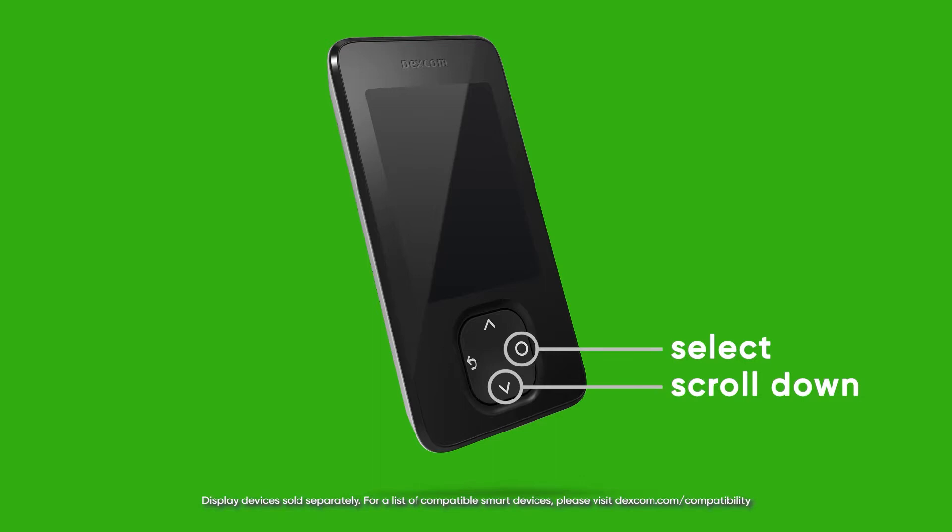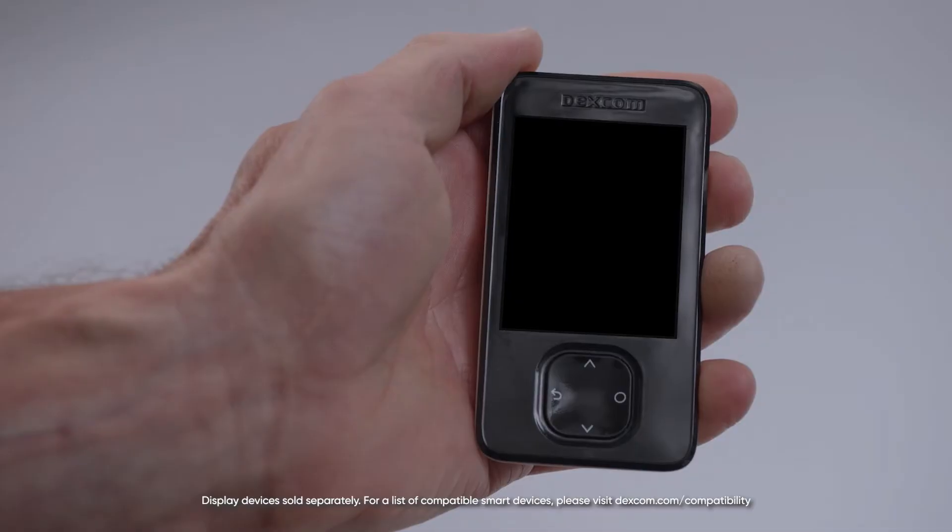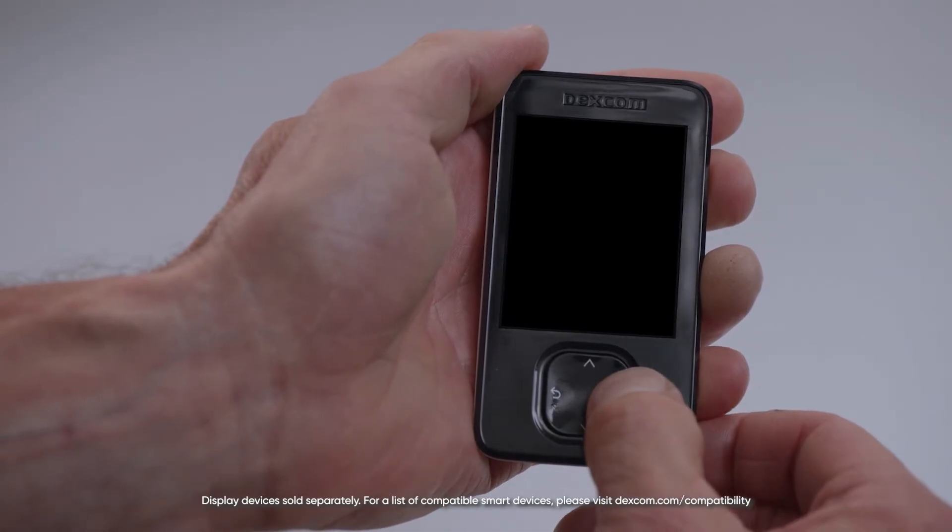Select, scroll down, go back, and scroll up. To turn on your receiver, press and hold the select button for three seconds.